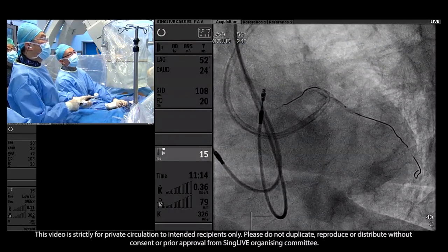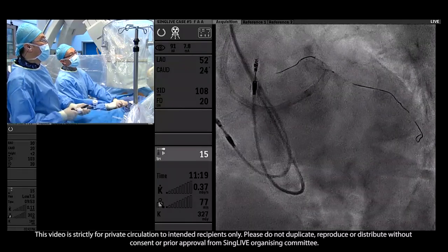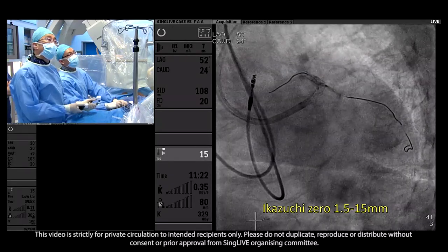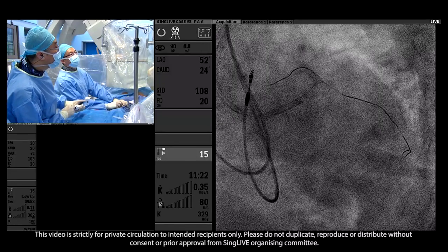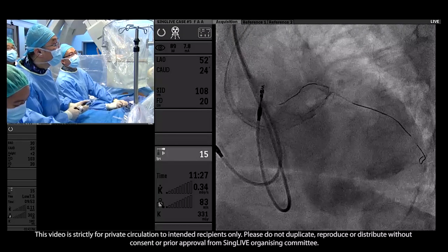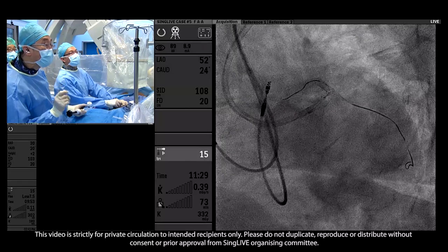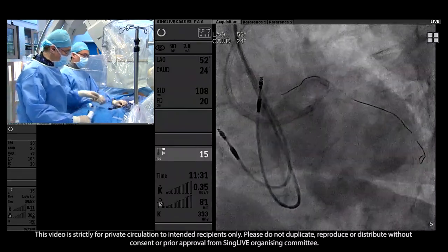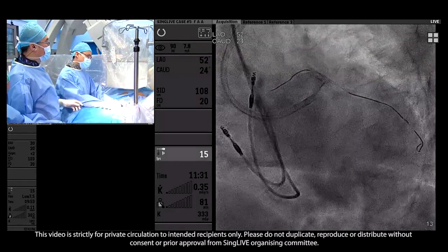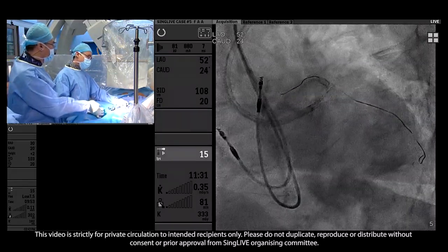It's a 1.5 balloon. Just a little bit of resistance going across the angulated lesion. 16 again. Okay, nice. We have to remember that the length from the circumflex ostium to the OM branch bifurcation was 10. 16. Okay, good. So we did not assess the proximal circumflex in the previous IVUS. It was 3.25. Go to 2.0 now again. Use the additional balloon and then put the stent. Nice. Go with the 2.0. The angulation, I think, is going to be a bit difficult.